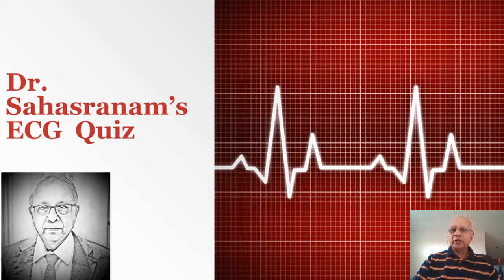I hope you have been enjoying this series of quizzes and are able to correctly interpret the ECGs which I am showing you. I would suggest that you should always update yourself with your previous ECG classes so that these quiz programs become more effective.